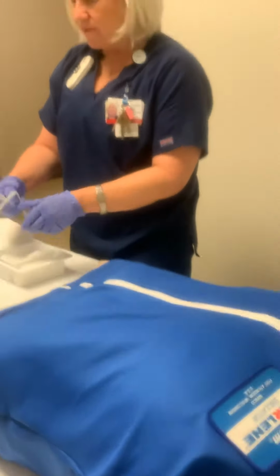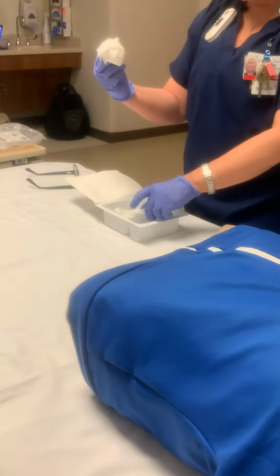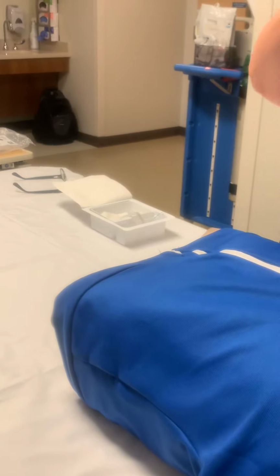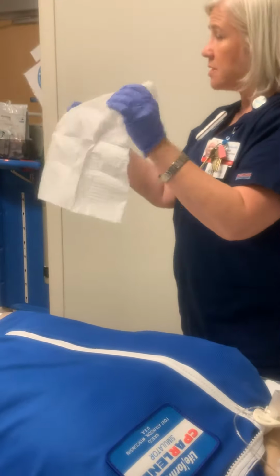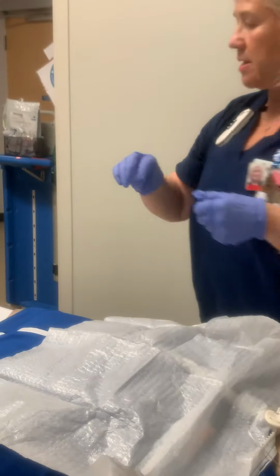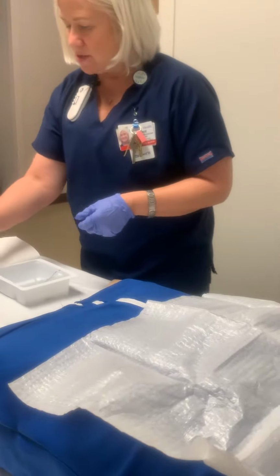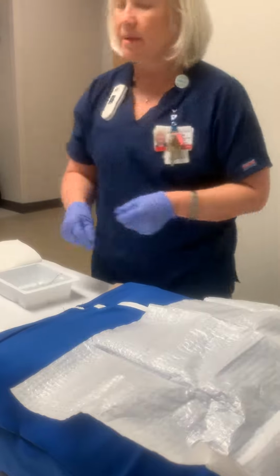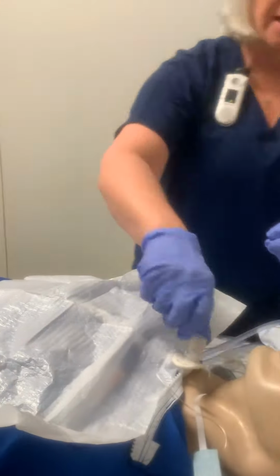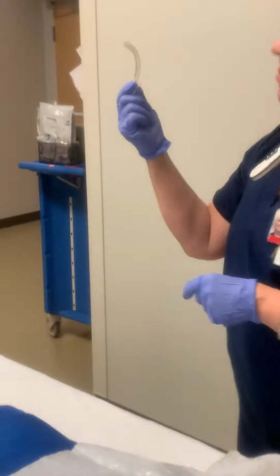So you have a bunch of 4x4s, you have your pipe cleaners, etc. And I usually like to put this on here. Nurses don't, it's not either-or, Banner doesn't really speak to it. I like to put it here, right like that, only because I can put my discards right here. Then you have a tray with your 4x4s here. You want to put your normal saline in here. Then I'm going to take out my inner cannula right here.